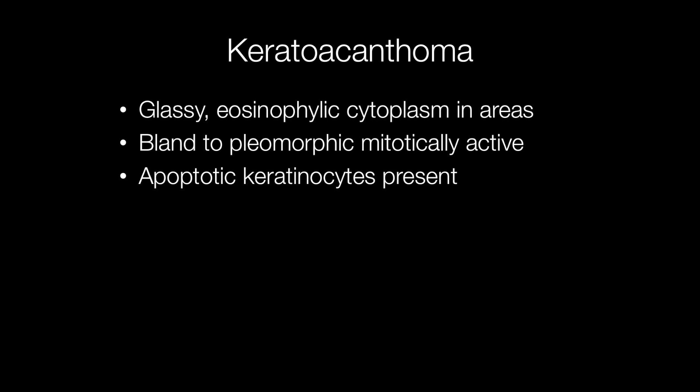On higher power, other features can be appreciated, such as keratinocytes with glassy eosinophilic cytoplasm. Nuclei may be pleomorphic and mitotically active, or they may be quite bland. Another feature is the presence of apoptotic keratinocytes.